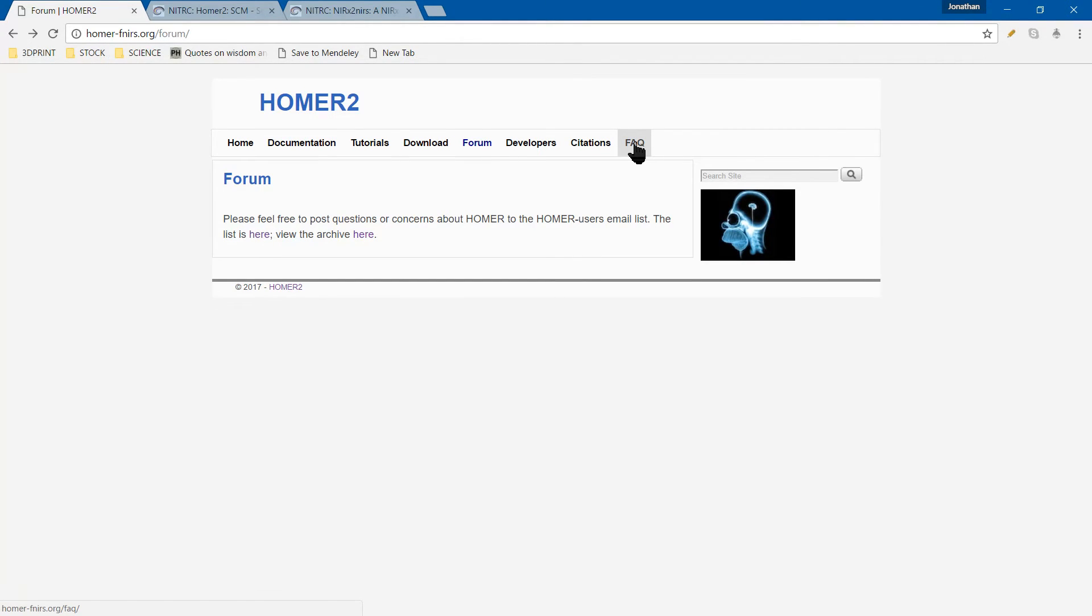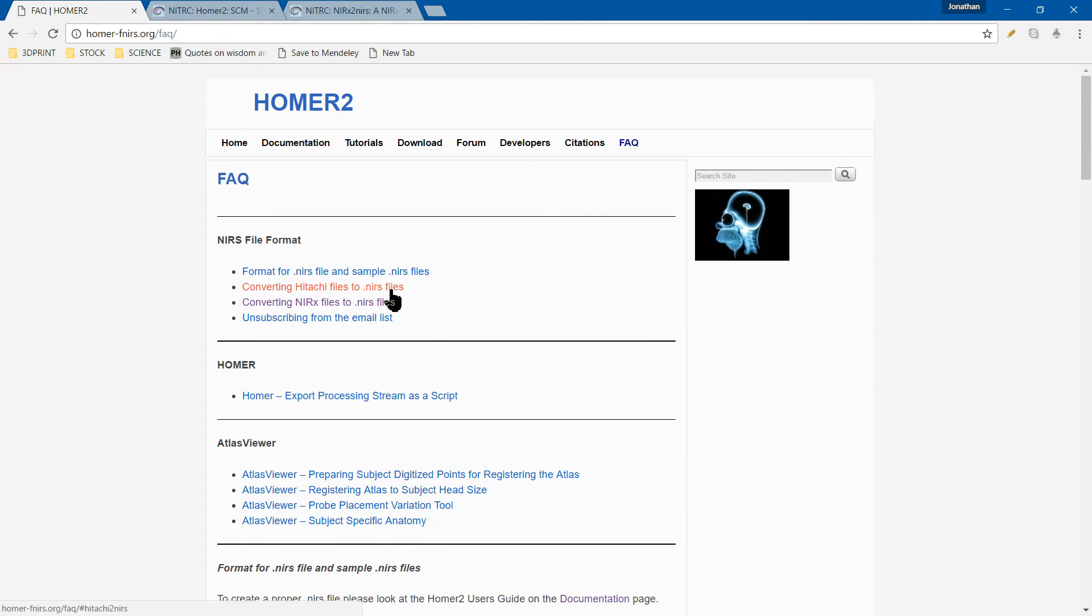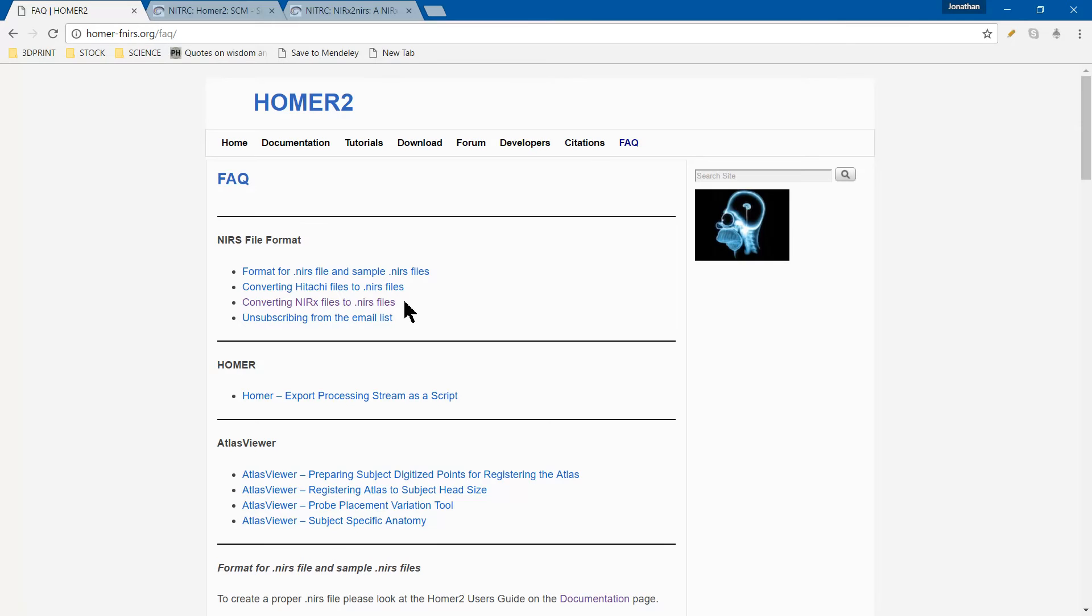Once you're at the website, you'll need to download HOMER. But you'll also likely need to convert your files. If you have either a Hitachi machine or a NIRX file, there's code provided. You'll have to change it slightly to match your computer, files, or data, but the skeleton is there. We have the NIRX file and we've adapted it to fit our data. Once you run the data through that, it converts nicely and you can feed it into HOMER without too much trouble.